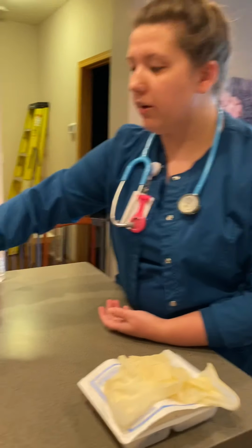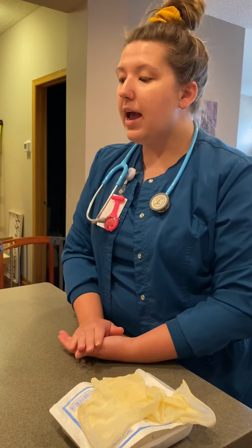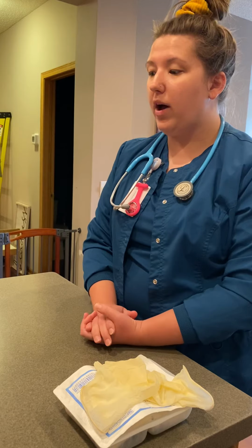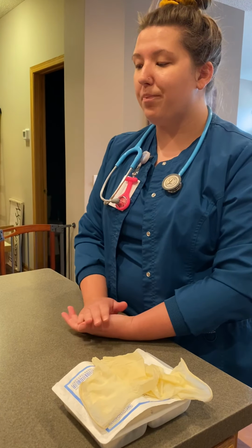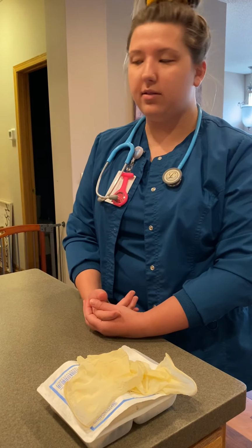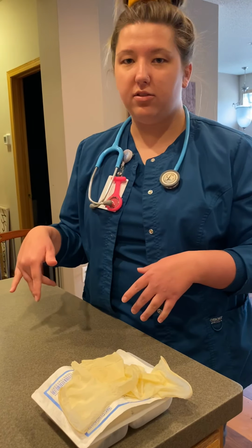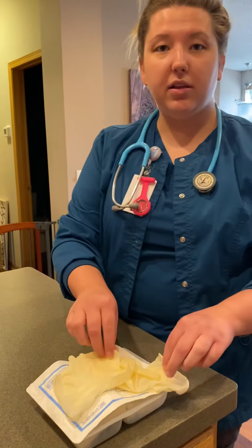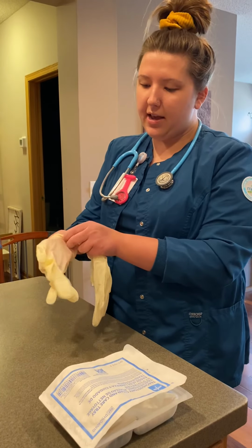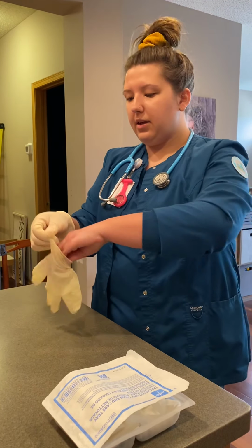So I'm also going to take a feel for the pulse, and I'm going to monitor respirations and look for cyanosis, also oxygen saturation, as well as seeing what the patient's level of consciousness is and seeing if there's any changes in behavior like restlessness. So now that that is all good, I'm going to put on some clean gloves and take out the fenestrated dressing. So I have my clean gloves here, and I would have washed my hands before I put my gloves on. So wash my hands, and I got my clean gloves. Bear with me, they're a little tight, but got them on here.